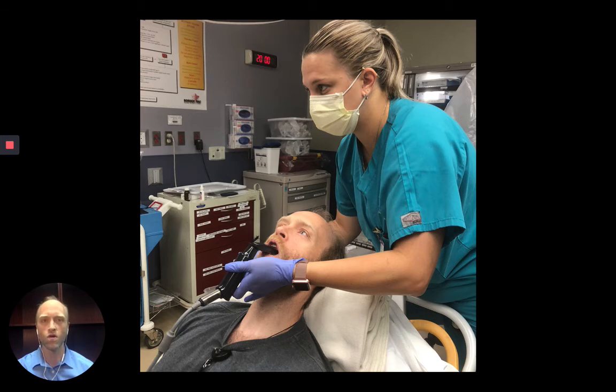As you enter the oral cavity with the VL blade, try to avoid touching any soft tissue until you have your blade tip in the vallecula. For this reason, the standard geometry Mac blade is preferred over the hyperangulated. Then you just insert and pass the tube while trying to avoid contacting any soft tissue. Using a bougie to assist is also a good option.